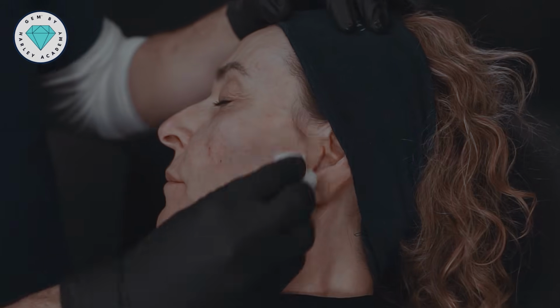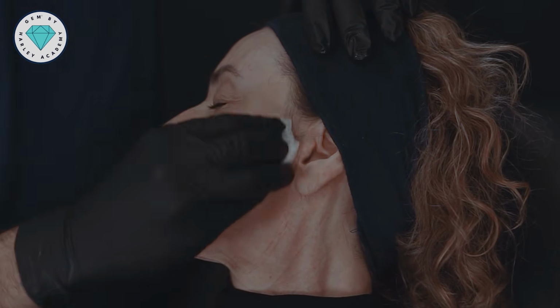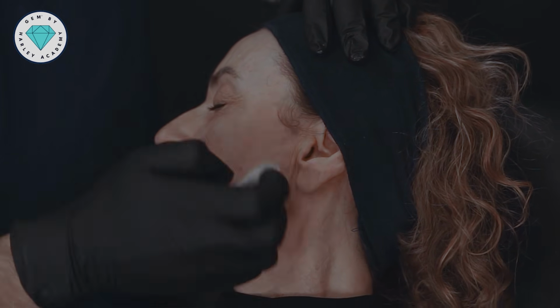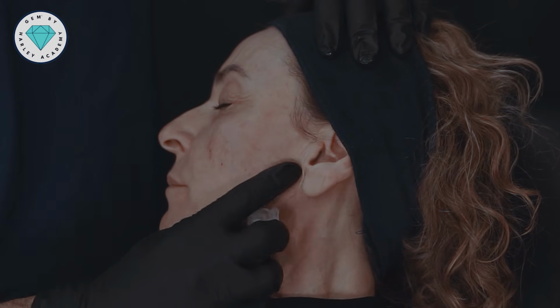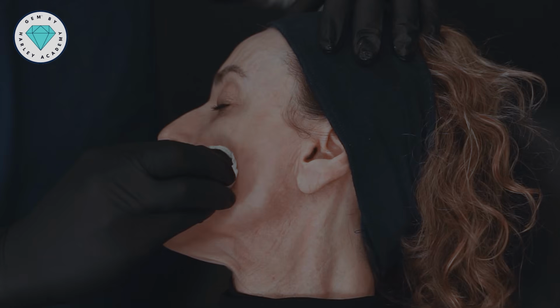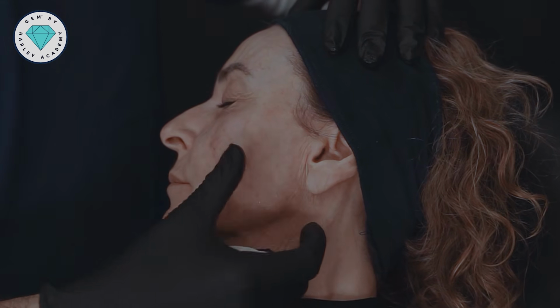Great. So this one, it's okay to massage. We're going to create these little linear tracks under the skin, and we just want to try and flatten those, help the product spread evenly under the skin. When we're using a low viscosity and highly cohesive gel, that's very straightforward.